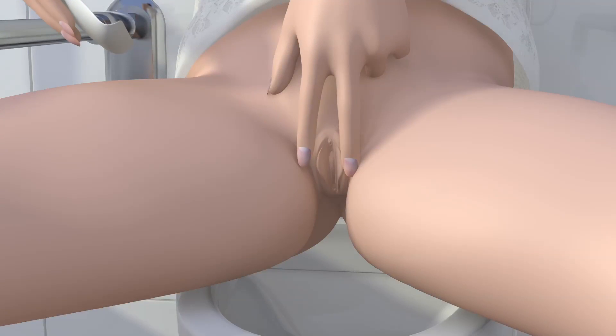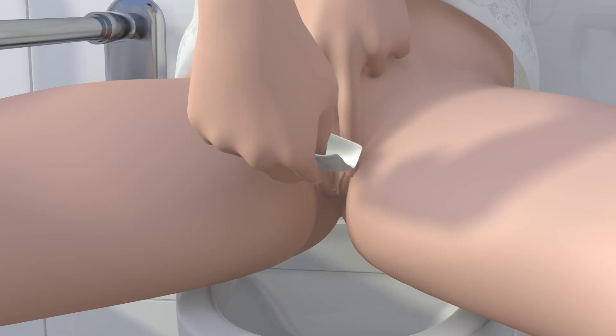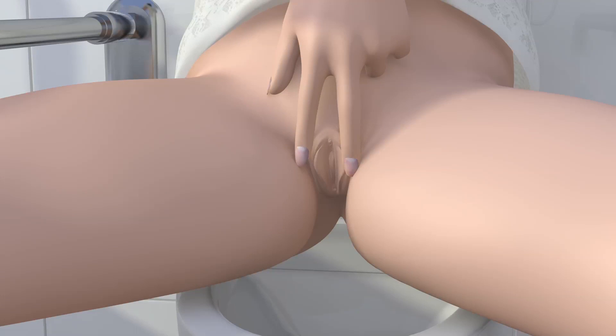Spread the labia, then cleanse around the opening of the urethra with a mild, unscented soap or a non-alcoholic wet wipe.